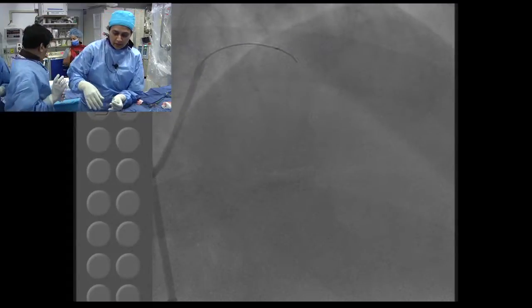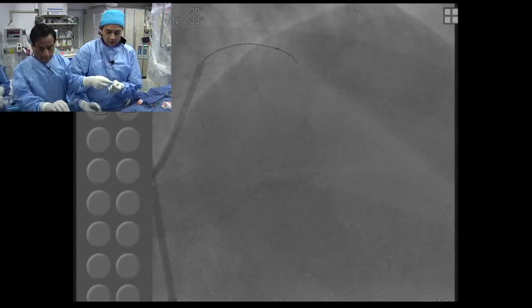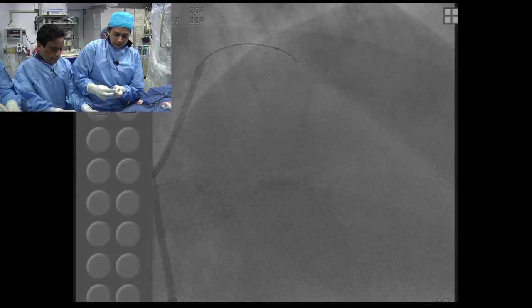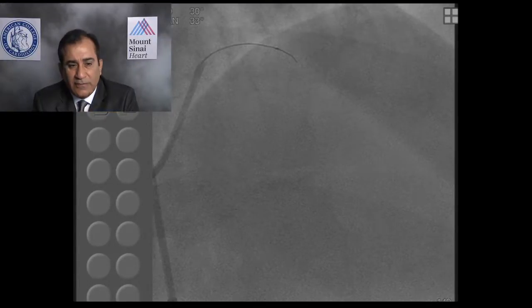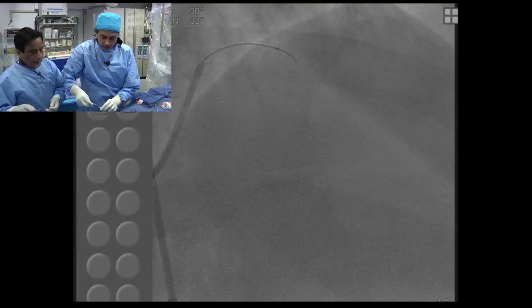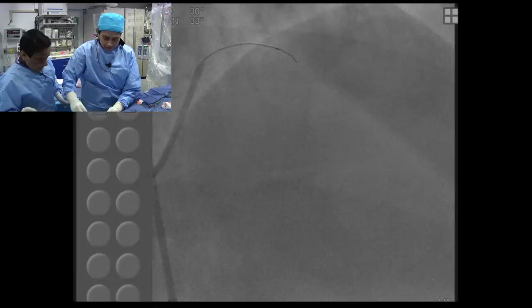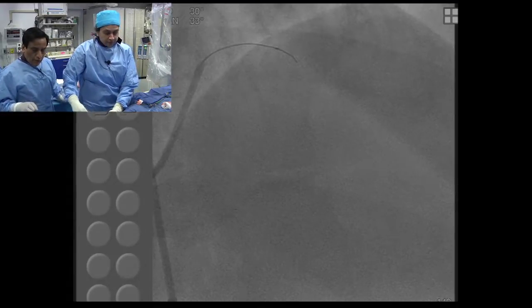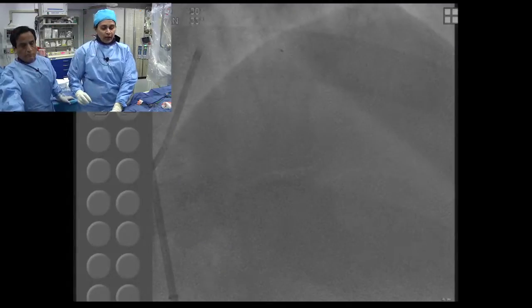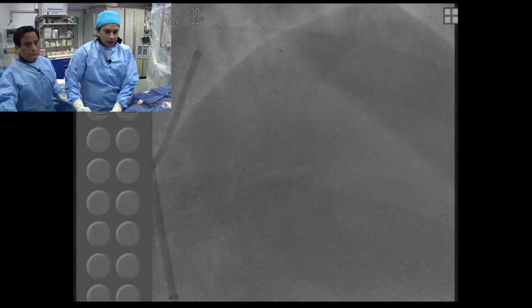Sameen, the first question from the presentation you made in your work published in the Journal of Invasive Cardiology: of the 28 patients, there were 24 successful with GuideLiners. What did you do for the other four? The other four, we can actually go back to that slide. Two were successful, I know. Yeah, and how, by doing the rotablation? No, then they needed rota. These are the cases where in the old days we would have had to do rota.